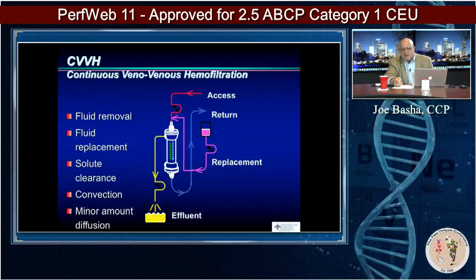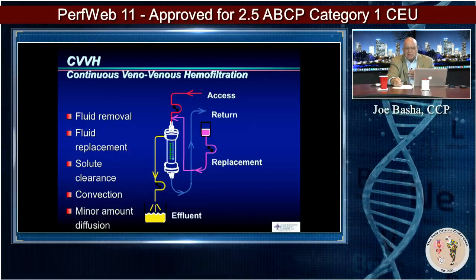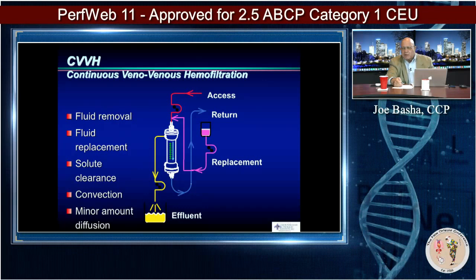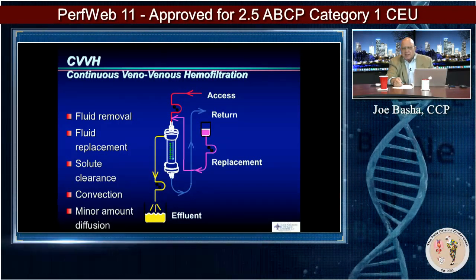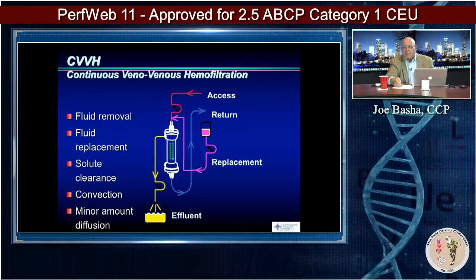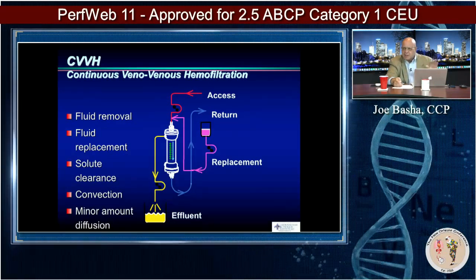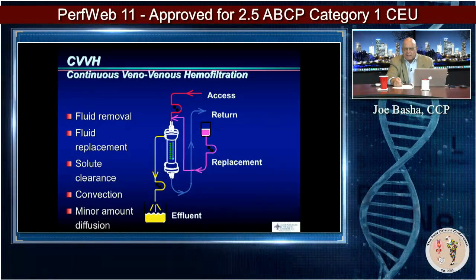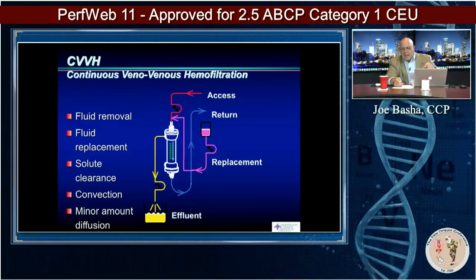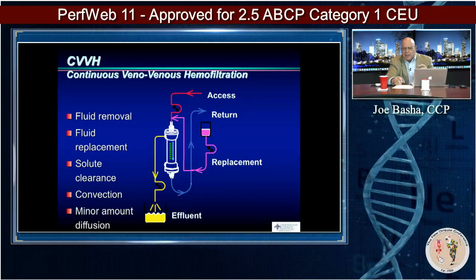So when you look at CVVH, which is my personal favorite therapeutic modality, it is used for fluid removal, fluid replacement, solute clearance, convective clearance, and a minor amount of diffusion. So you see the difference there, very minor amount of diffusion. But you see the red access coming in and then the blue going out back to the return.